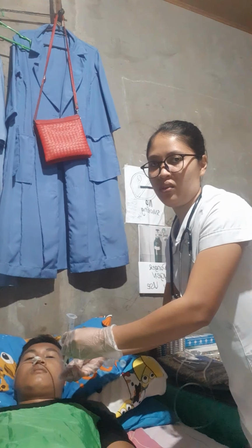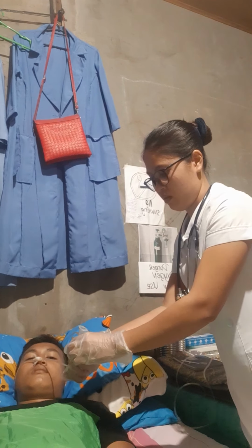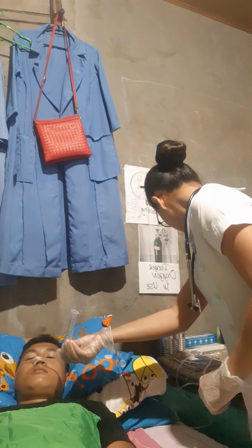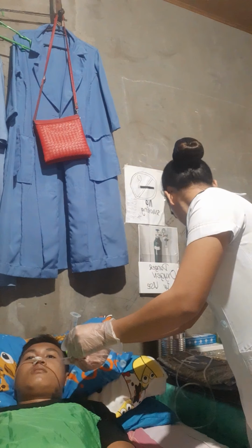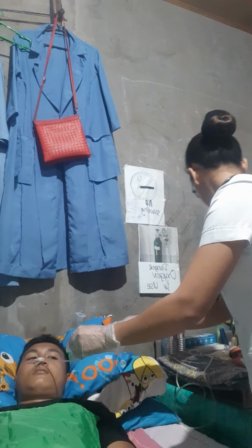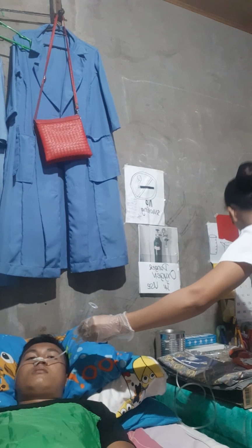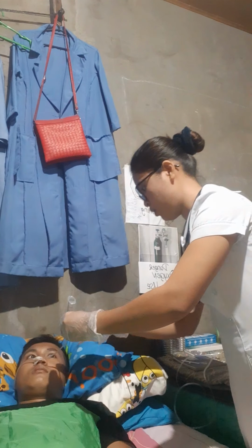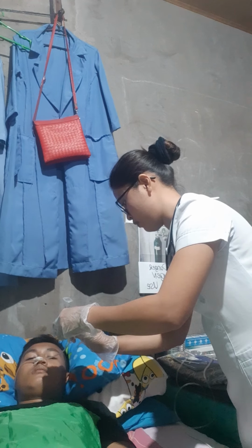Then add the feeding to the syringe barrel. So after that, we can add the feeding. It will be food or fluids.